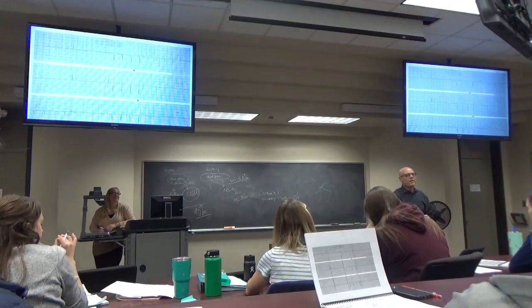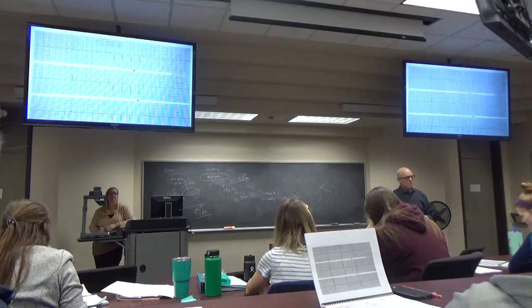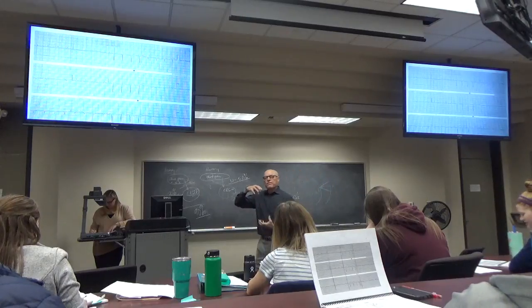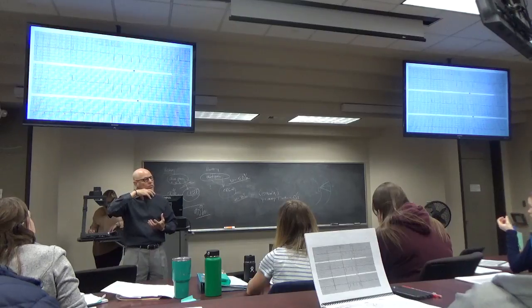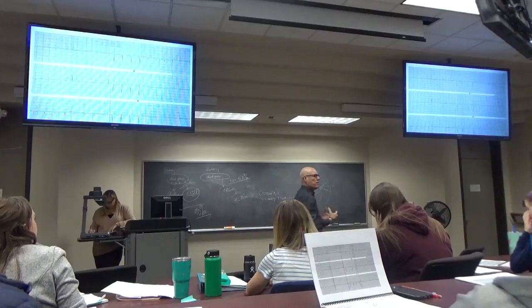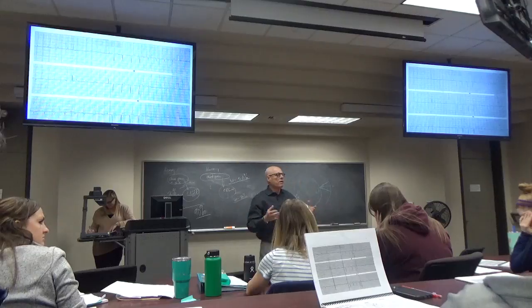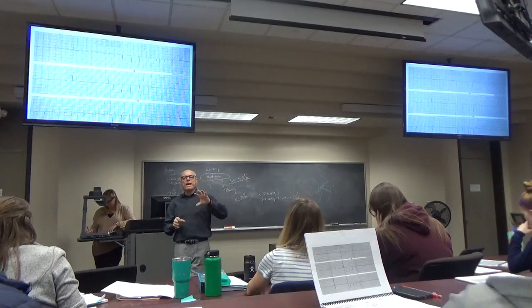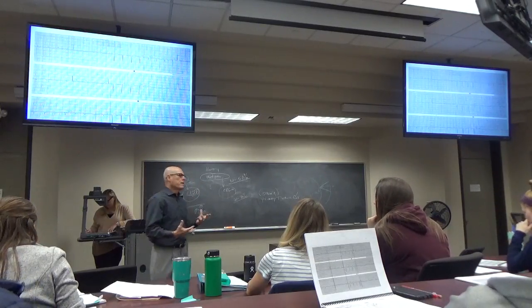What do you reckon might happen then? What? They'd be dead. Yeah. They'd probably be dead because this is the inferior wall of the, mostly the right ventricle. This is anterolateral, mostly of the left ventricle. You got septum. No, I mean, the whole heart's infarcted, you know? So it's unlikely that you would have an acute one here and an acute one here at the same time, and they're still alive enough to have an infarct.